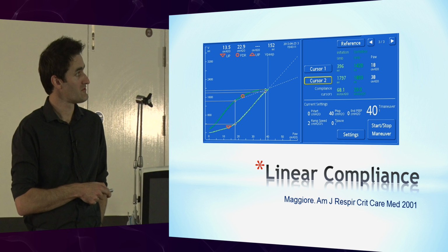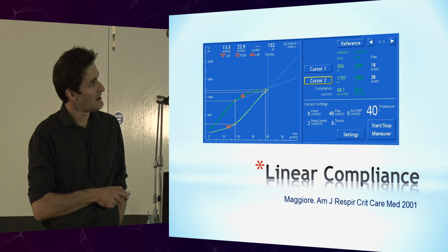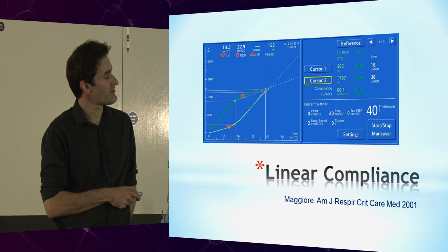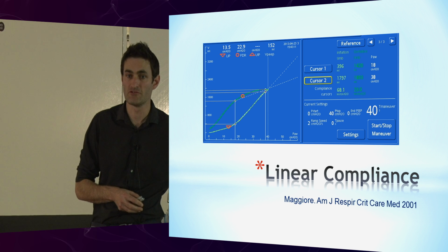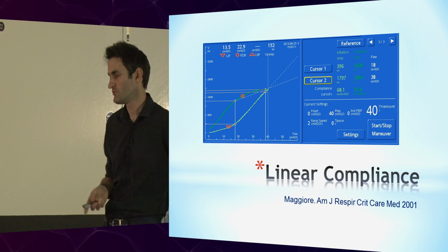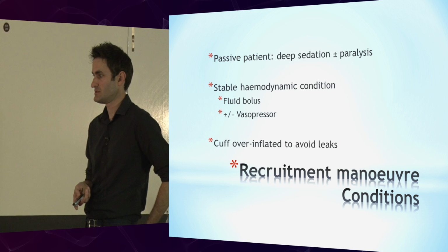So just in summary, if you've got a nice curve like this, so low inflection point, steep inspiratory limb, hysteresis gap here, probably recruitable lung. A line that goes like this and back down again, not recruitable. That's just the same thing again.